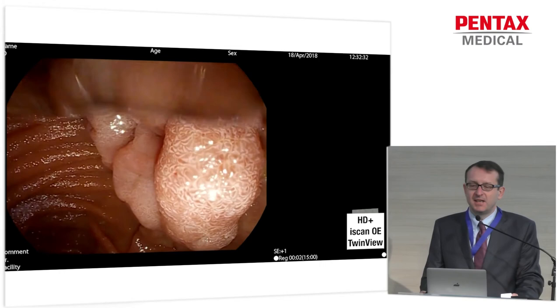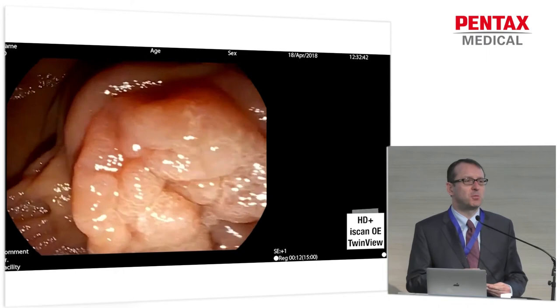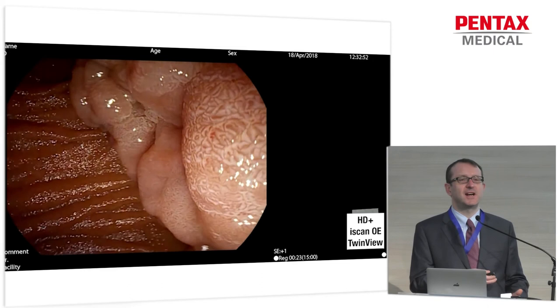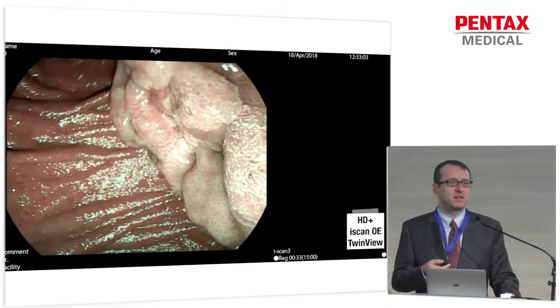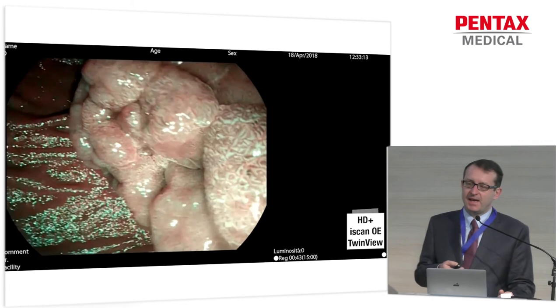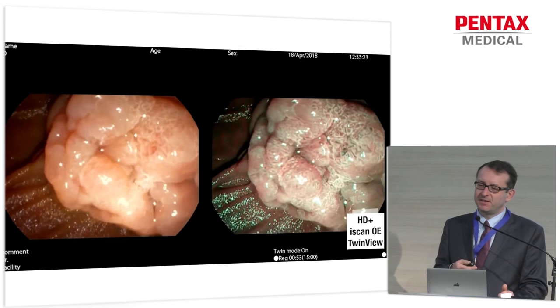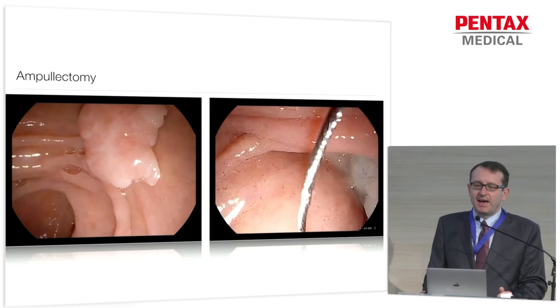Here are some examples. This is a case we just did the other day — we have a large ampulloma. Not only do you have a high-resolution image, but you can also use the image enhancement you use from your colonoscope or gastroscope: digital and optical filters, the iScan OE. And if you want to, you can even use the twin view, so you have the white-light picture on one side and the image enhancement on the other side. That really helps in order to assess the lesion correctly and base the decision on macroscopic appearance whether to resect it or not. On the right-hand side, you've got the OE; on the left-hand side, the white-light picture.